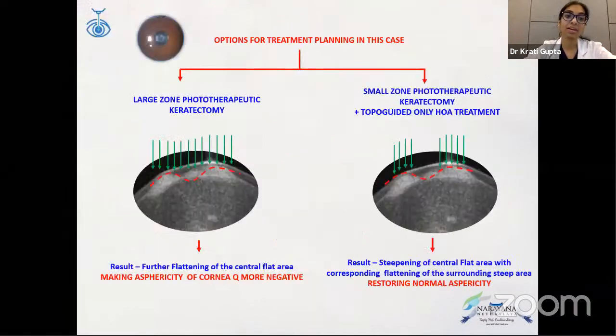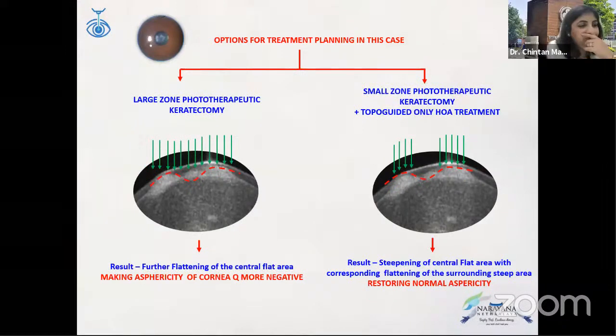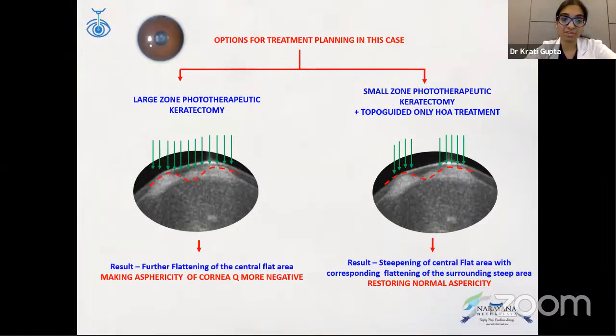Next slide, please. So our two options is large zone phototherapeutic keratectomy, but as I said, it would lead to further flattening and the hyperopic shift.